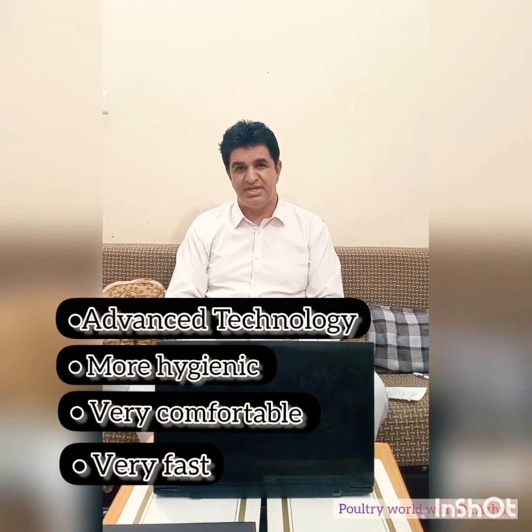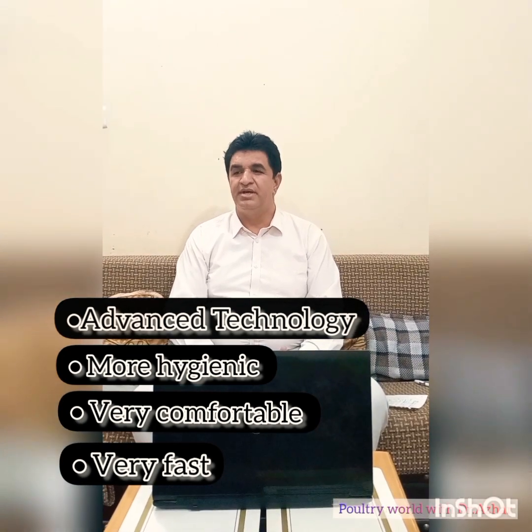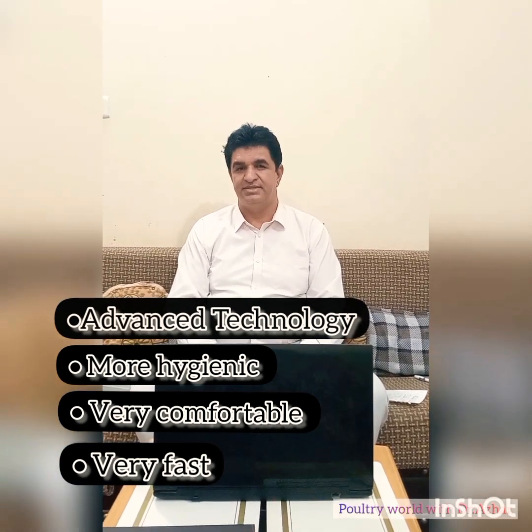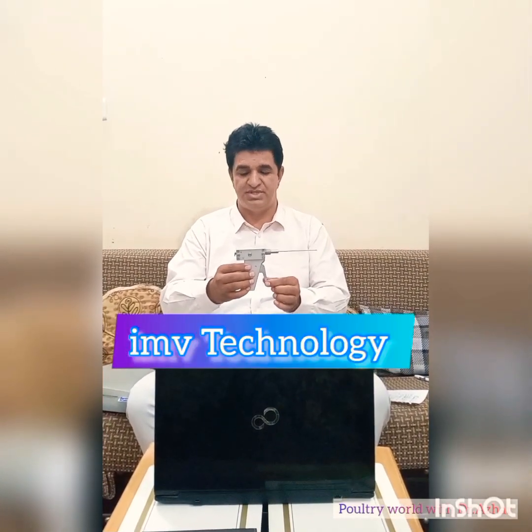I will discuss in this video about this new technology. It is a very latest technology, very comfortable, hygienic, more hygienic, and very fast. Commercially it is used in grandparents, parents, and all research setups. In this technique the volumetric gun is the basic and most important tool. This is the volumetric gun and it is from IMV Technology, France.